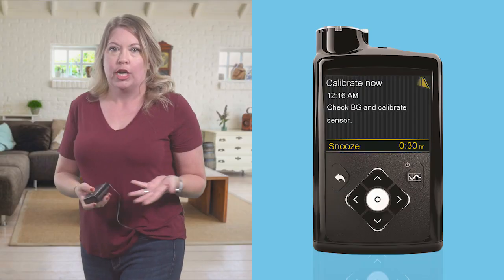I found the system works best when I do three or four calibrations a day when my glucose is stable. For example, I like to calibrate before bed and before I eat. When your pump and sensor need a calibration, you'll receive a message that looks like this on your pump screen.